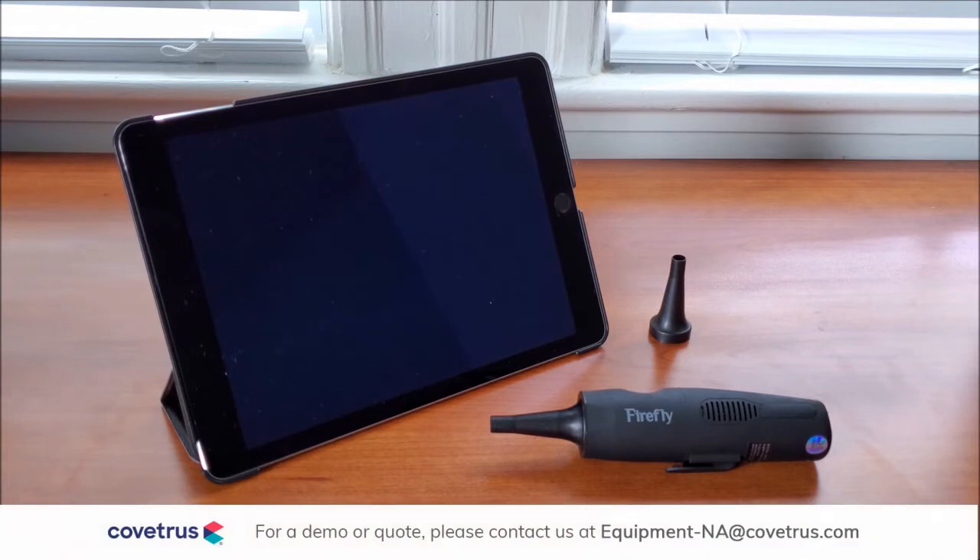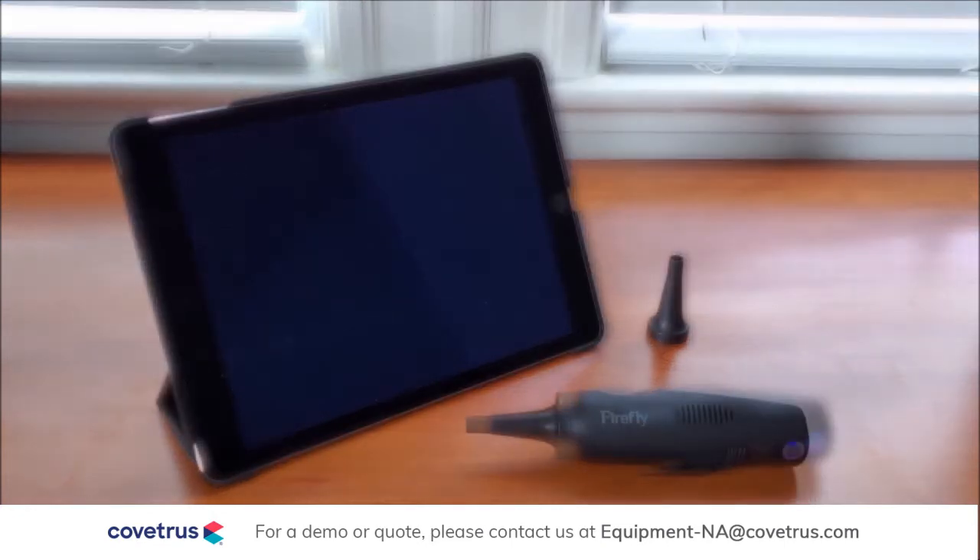In this video, we will be looking at the DE571 HD Wireless Veterinary Video Otoscope from Firefly and how it connects to your iPads, iPhones, and Android devices.